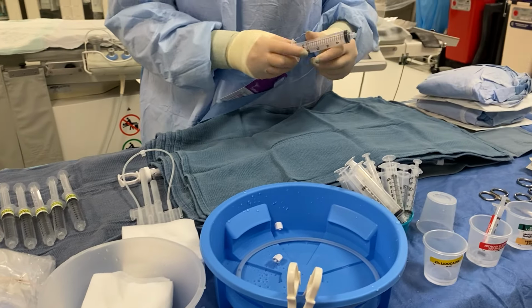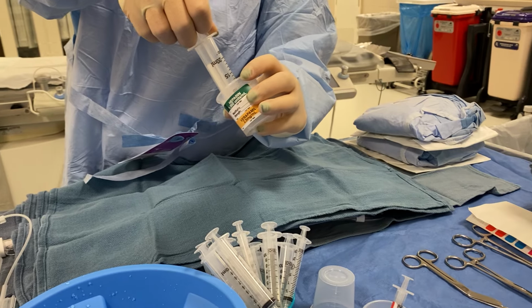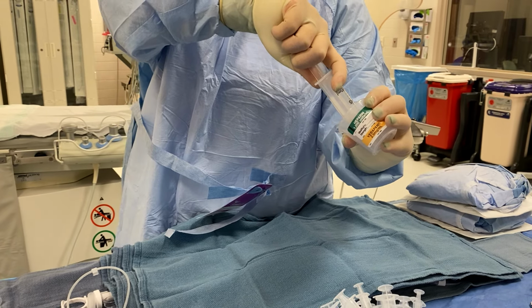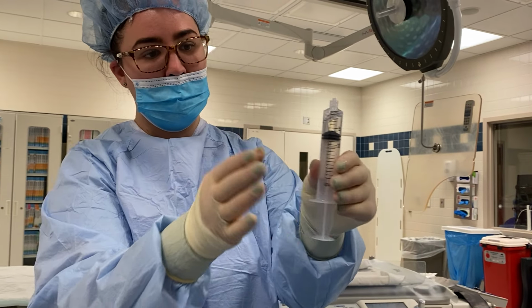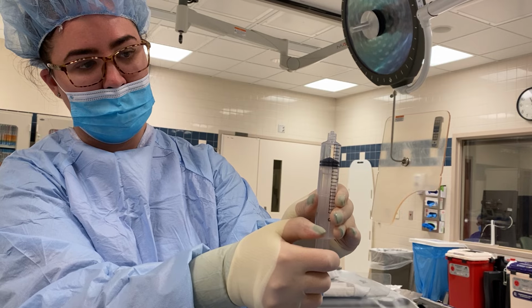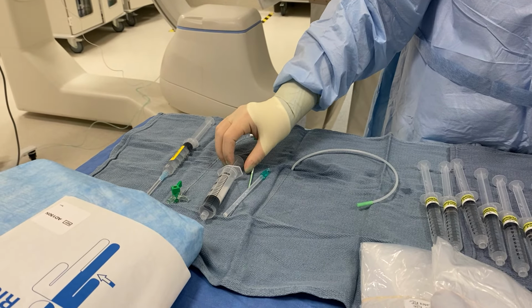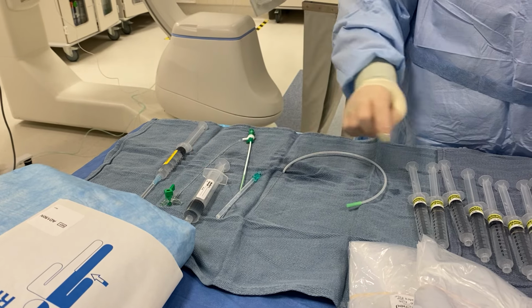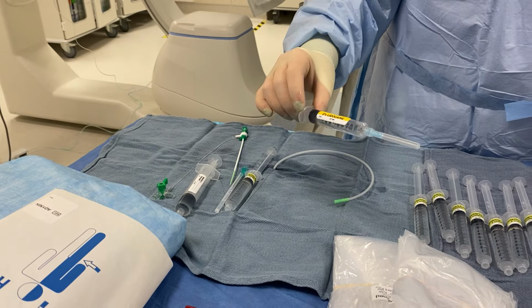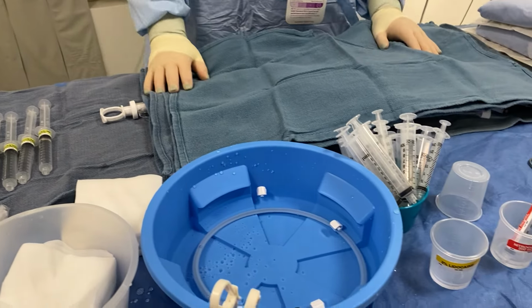And then my radial cocktail is already in the cup. So I'm just gonna draw all of that up into this syringe as much as I can. And now I have air in there. Just gonna give it a tap, get rid of all those bubbles. Push all the air out and set it right over here because the doctor is gonna need that for access. And I'm gonna position it label facing up so that the doctor can clearly see what it is. And I did the same with my lidocaine. And that's how you set up a table.